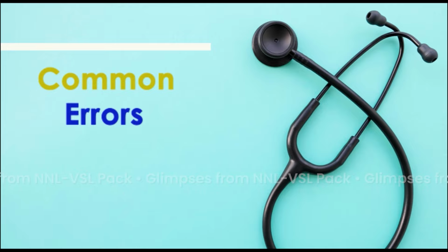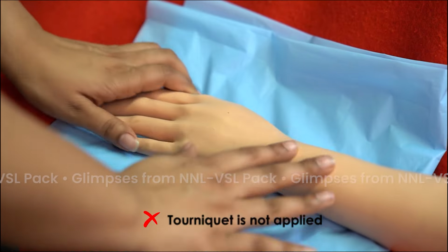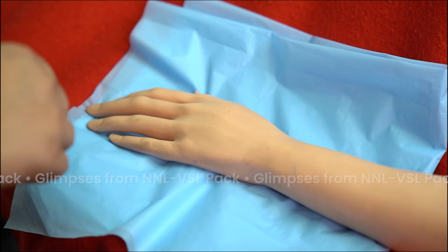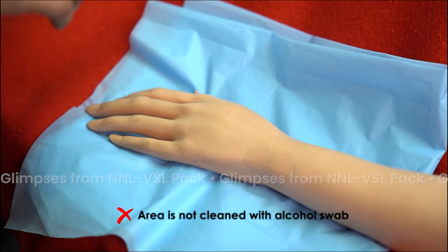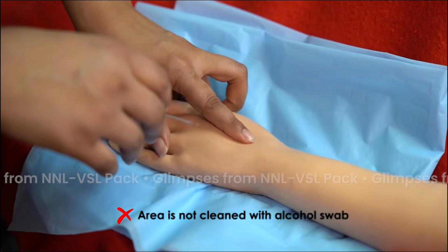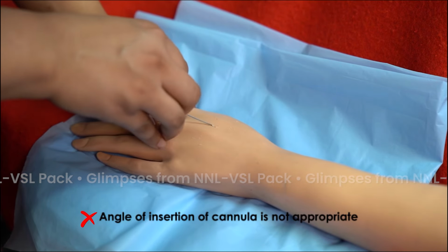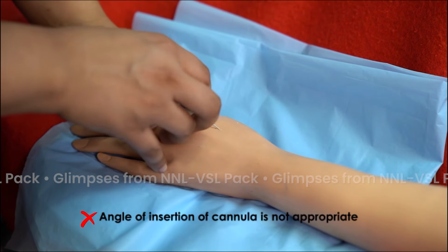Common errors. Tourniquet is not applied. Area is not cleaned with alcohol swab. Angle of insertion of cannula is not appropriate.